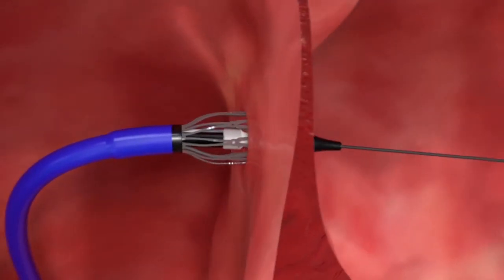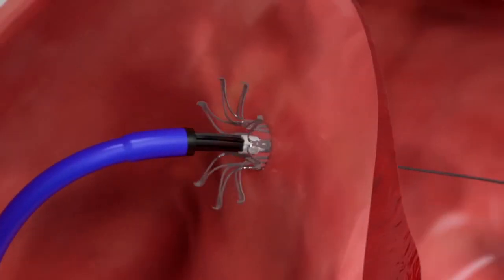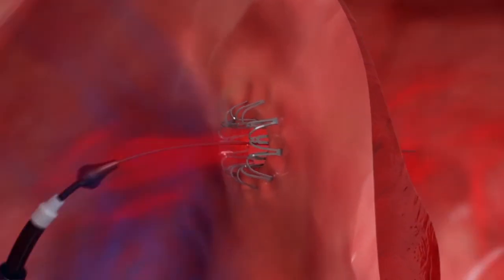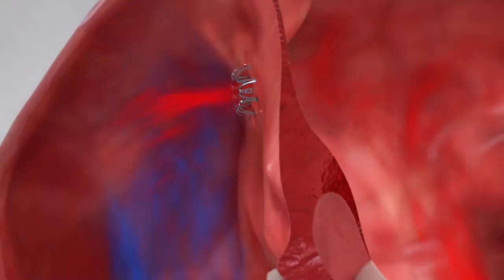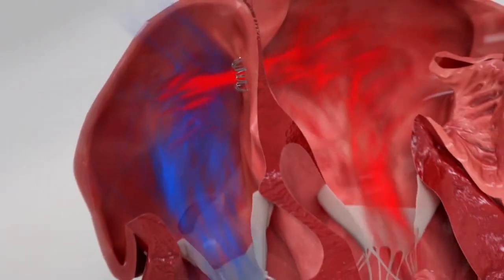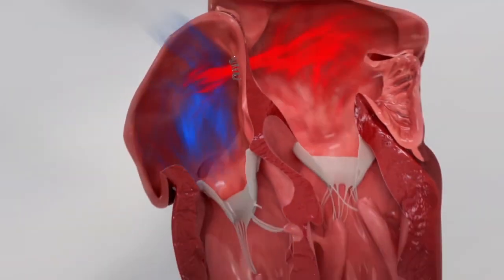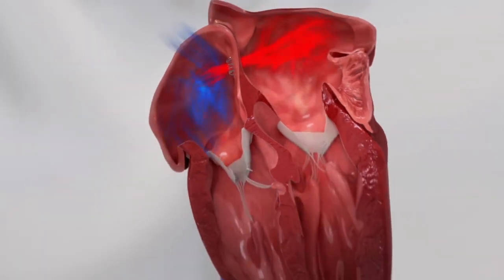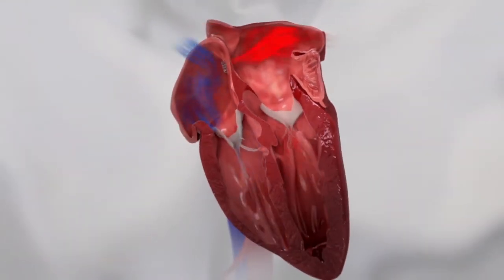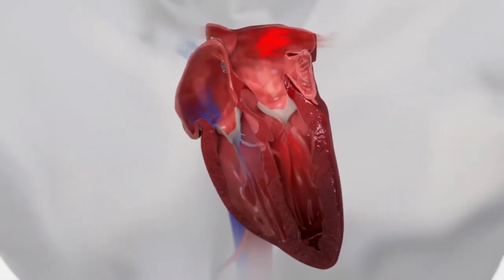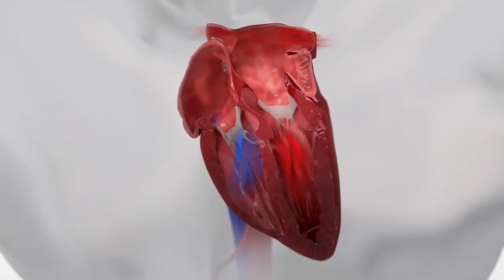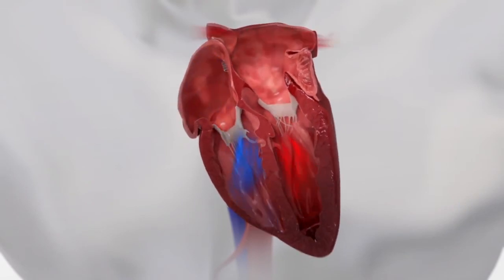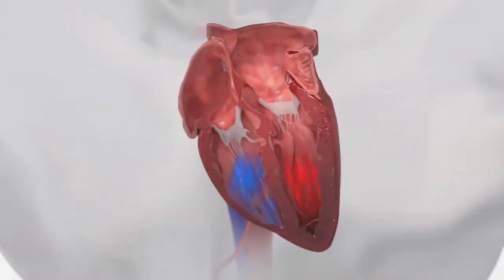The delivery system and guide wire are removed, while the implant remains securely in place. Blood now flows from the high pressure left side to the lower pressure right side, potentially lowering pressure in the left atrium, which may reduce the symptoms of heart failure.